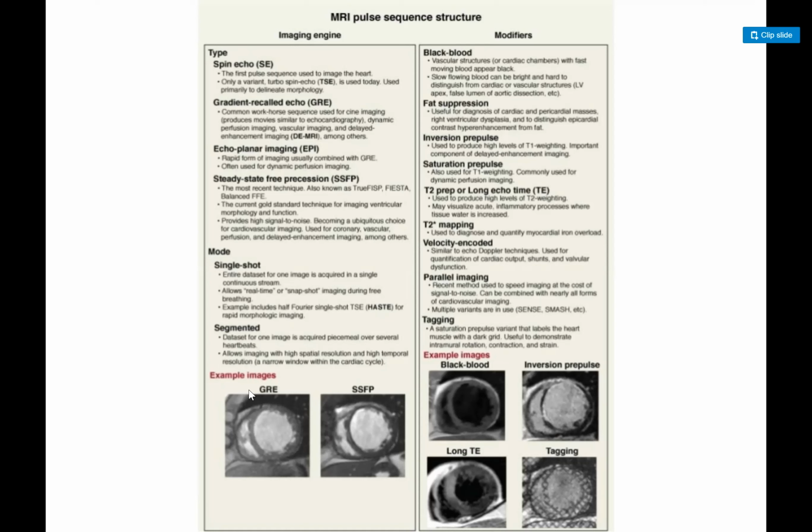The images look similar, but do we do both in a given examination? No, we do not do both. We do preferably SSFP. There is a difference. In these pictures you cannot see it, but the differentiation between the blood pool and the myocardium is different. So gradient echo is inferior to SSFP.